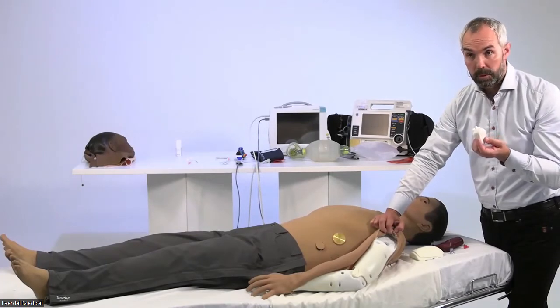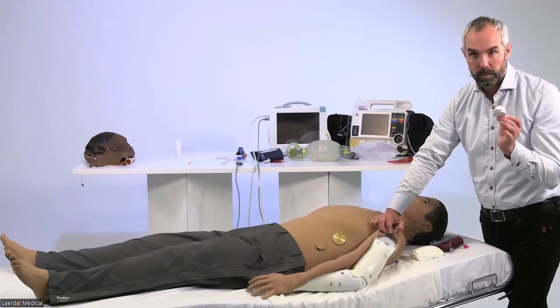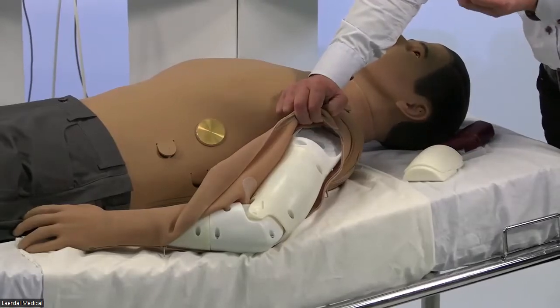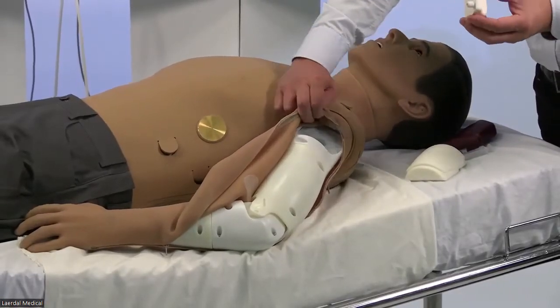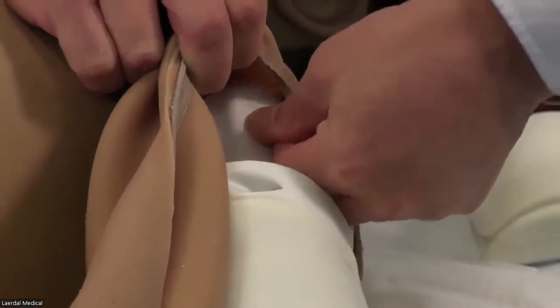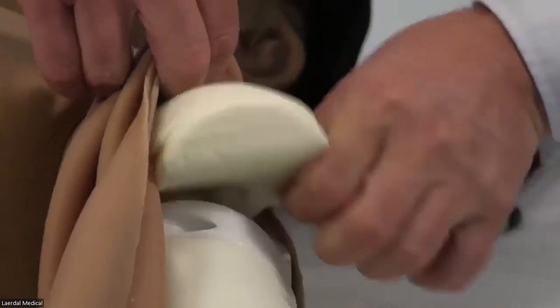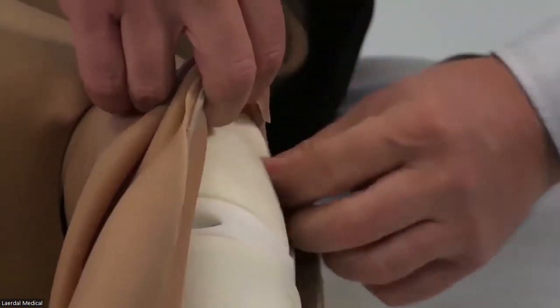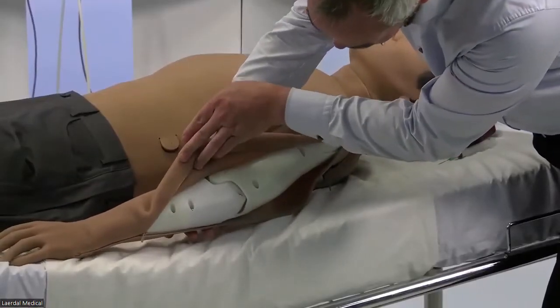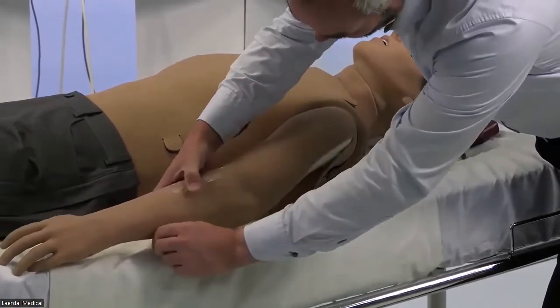But it is, of course, important that you don't add fluids into the arm without the proper spare parts. And it's easy to assemble and put the pieces back in its place. So attaching the IO bone, pushing in the foam for the IM pad, like that, and ensuring that the proper connections are on the underside of the silicone skin, and then close the zipper.